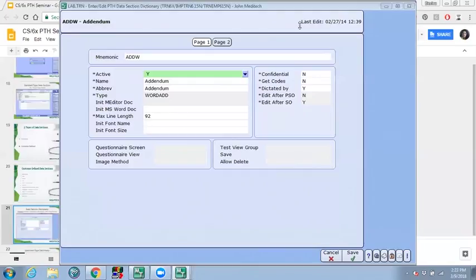However, these are very specific questions that might be pertaining only to your system. So the better way for us to approach your questions will be to open a task with your specialist, and I will be more than happy to assist your specialist as well with it. But if one word within the entire findings needs to be bolded out, it has to be a manual process. We cannot tell the system to automatically do it for you.